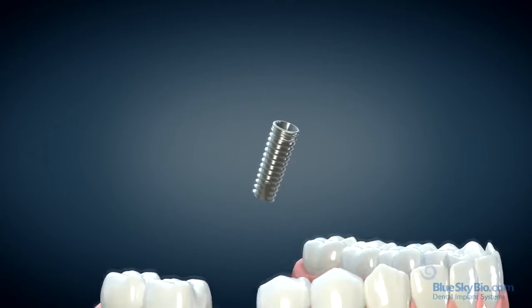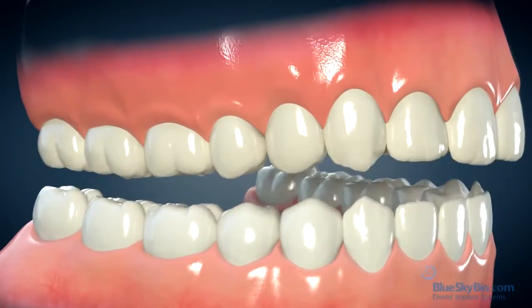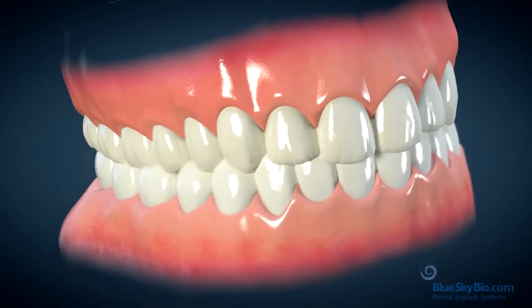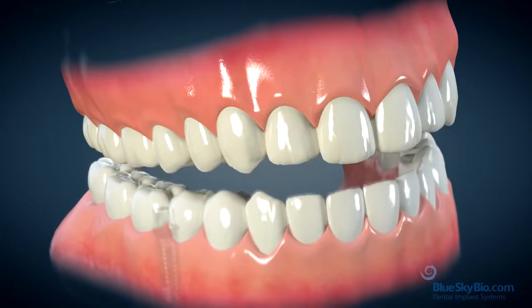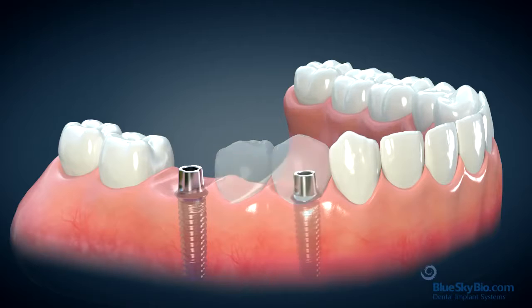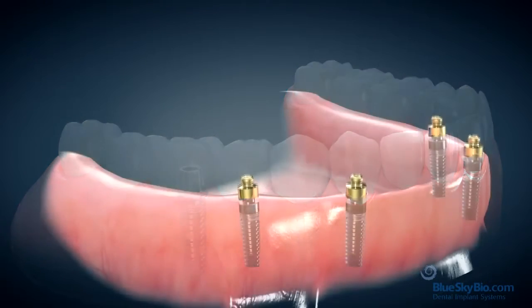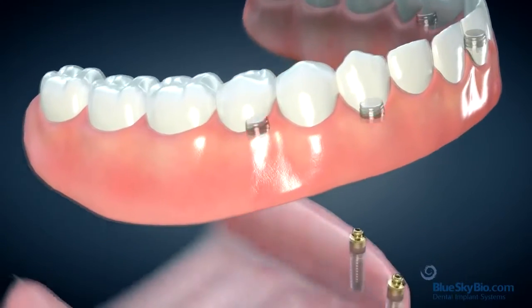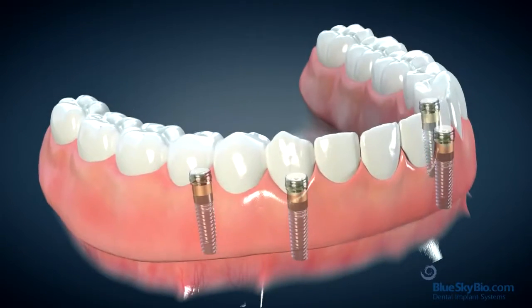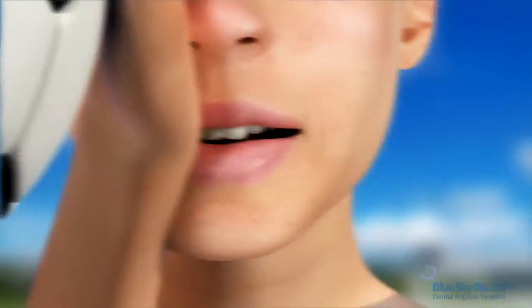So what exactly are dental implants? Dental implants are a different way of replacing lost teeth, as they are fixed in your jawbone so they function more like a natural tooth. Implants can be used to replace a single tooth. They can replace several teeth to hold a fixed bridge, or they can be used to secure removable partial and full dentures. They can replace teeth lost to disease or teeth that may have been knocked out due to trauma, for example, when playing sports.